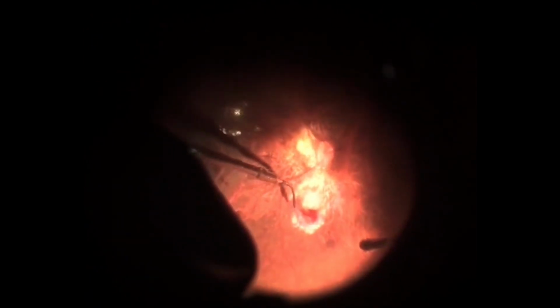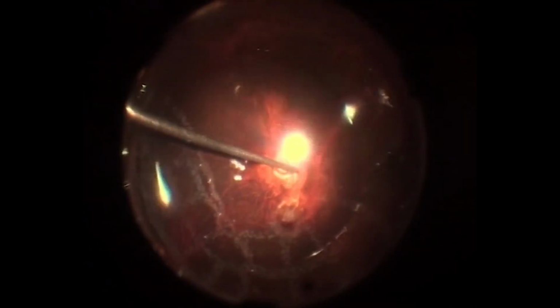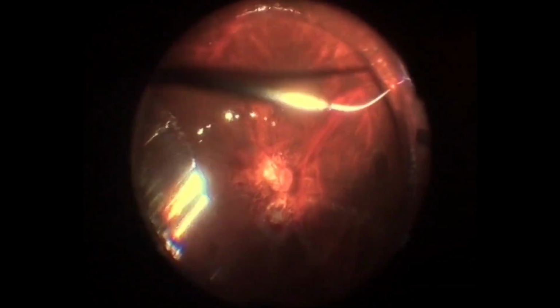Checkerboard pattern endolaser was applied to achieve complete retinochoroidal adhesion. 360-degree retina was inspected for other breaks. Perfluorocarbon liquid was replaced with 5000 centistokes silicone oil. Buckle was left in situ as there were no signs of infection.